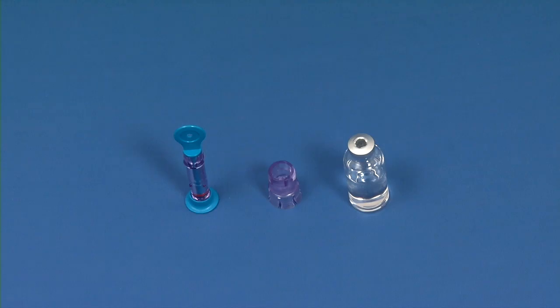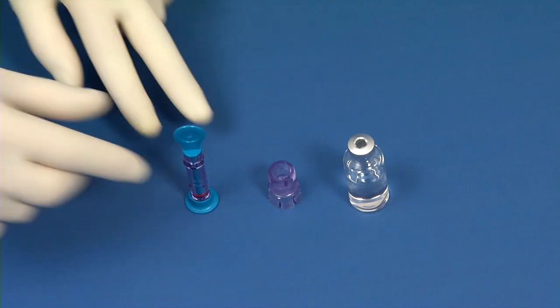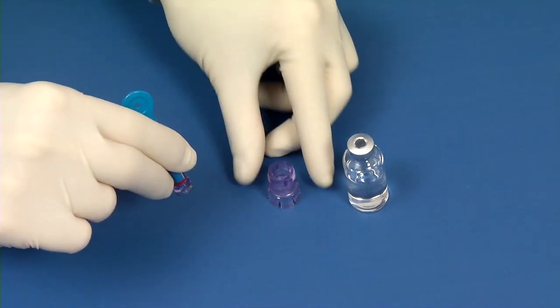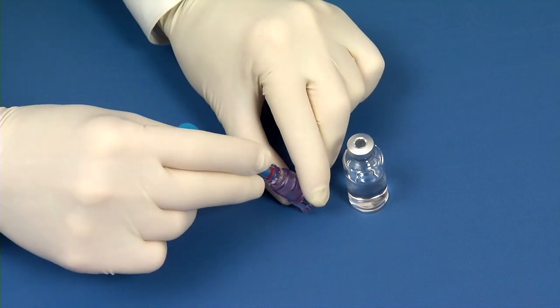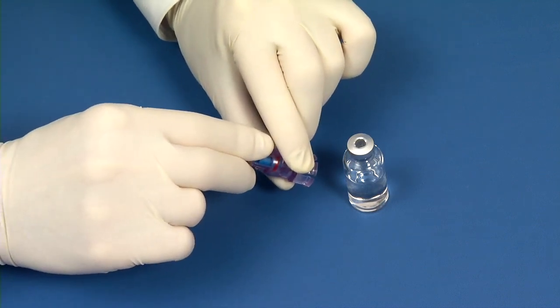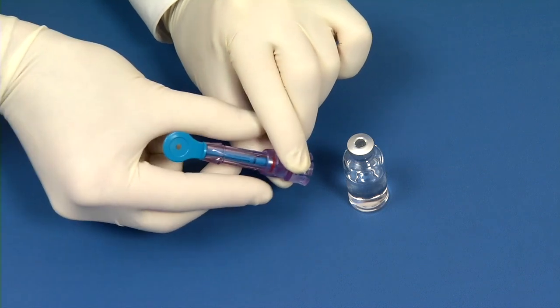To transfer the solution from the vial into the needle-free syringe, remove the blue protective cap from the syringe. Attach the needle-free syringe to the vial adapter by pushing the end of the syringe down into the top of the vial adapter and twisting clockwise to lock it in place.